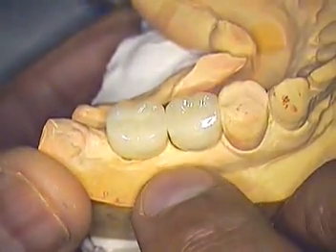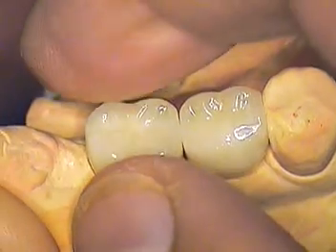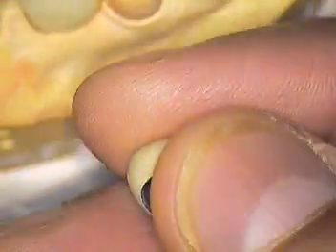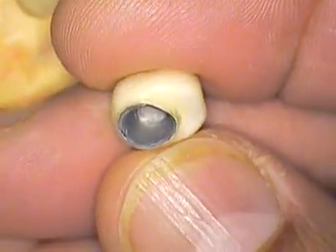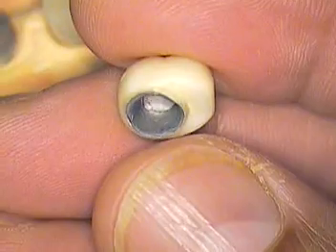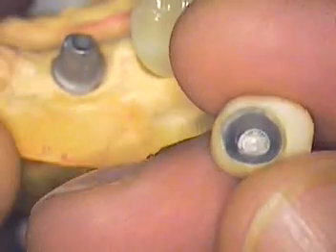These are the crowns. As I take off the crowns you will see what the custom abutments look like. There is one — this is the understructure. Right away you can see that there is plenty of material, dental material, porcelain that had to be built to the mesial since we were off almost a half a tooth with the implants.